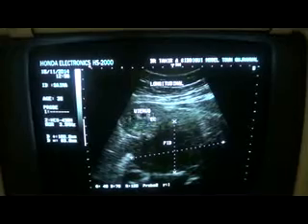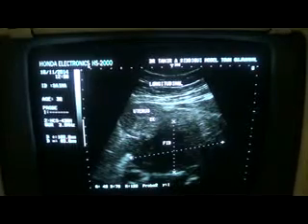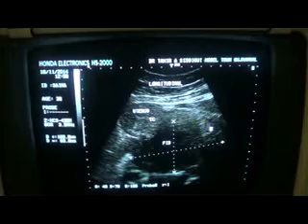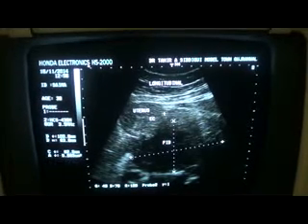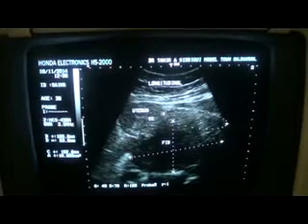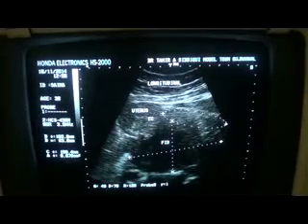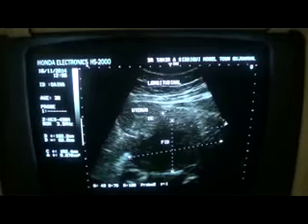Elevating the uterus. Now this is the uterus elevated. This is the urinary bladder, and the elongation of the lower segment of the uterus along with the cervix is because of the pressure from a mass which is a fibroid posterior to the uterus. Now this is the myometrium, anterior myometrium, which is encircled.